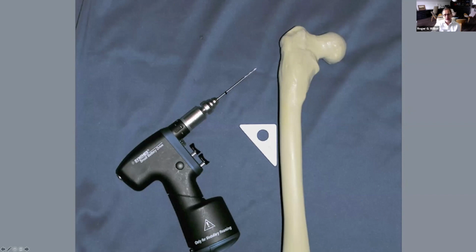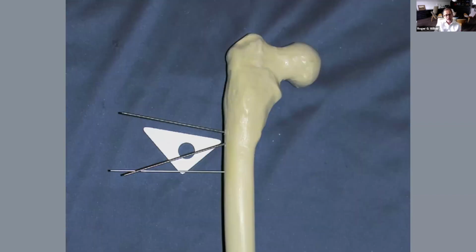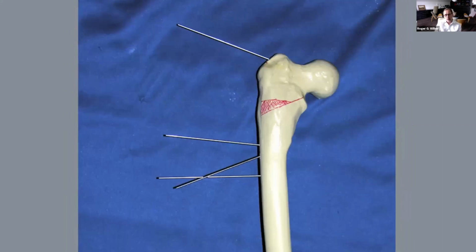When you go to put the pins in, I would suggest that the pins go in using this 2 millimeter drill bit. This 2 millimeter drill bit is really quite good, and it's better than putting the pins in not under direct power, because the pins tend to bend as they go in. So I'll put it in with this and then just slide the pins in by hand. Again, start with the 90-degree reference pin, and put your second pin in. This one happens to be 70 degrees to guide the lower cut. Put your next pin in to guide the upper cut of your osteotomy, and then figure out where your blade plate chisel is going to go, where the start point is for that, and where your cuts are going to be.